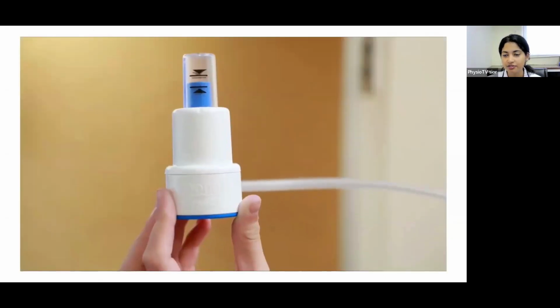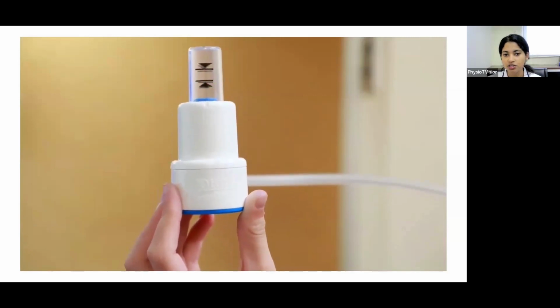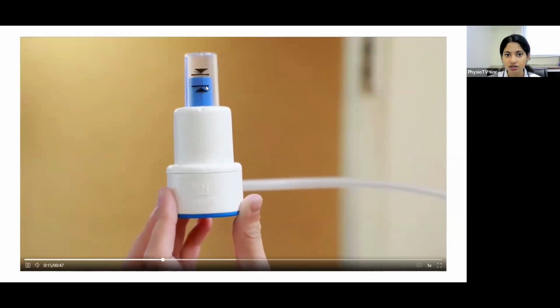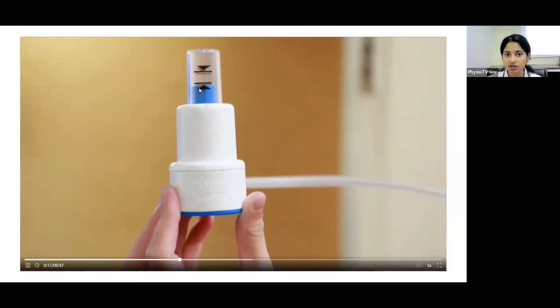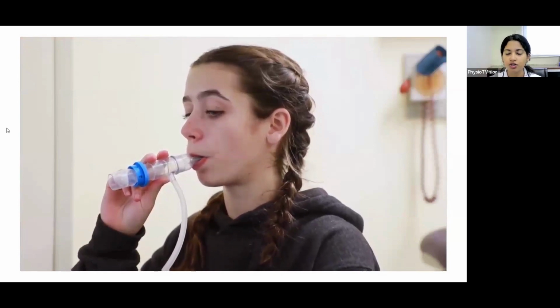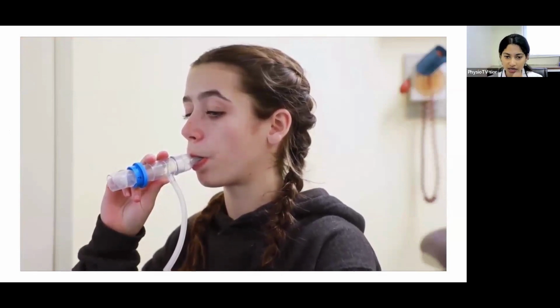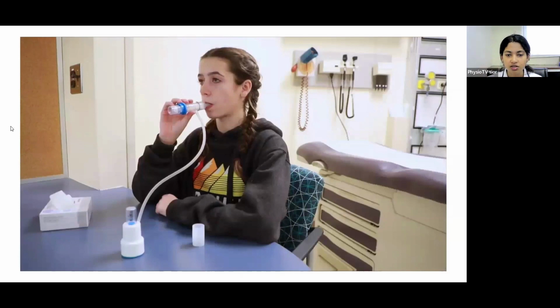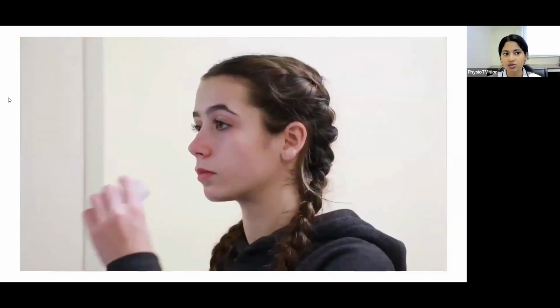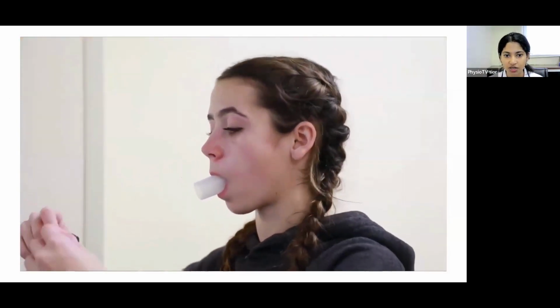She's inspiring from around the area of the mouthpiece or through the nose and expiring into the device, which is causing the chamber or the marker to move between the two gradations. Okay, so it is important to maintain the marker between these two gradings so that you are aware that that much pressure is being generated.